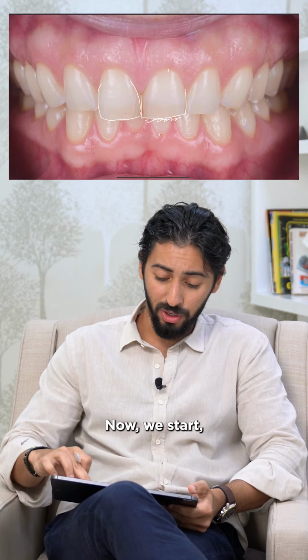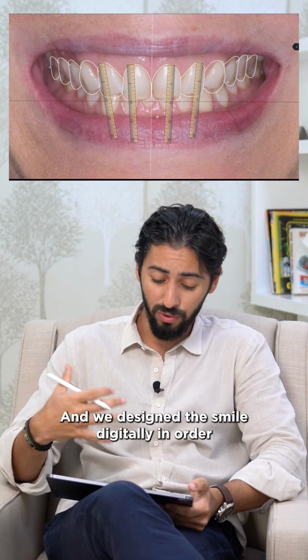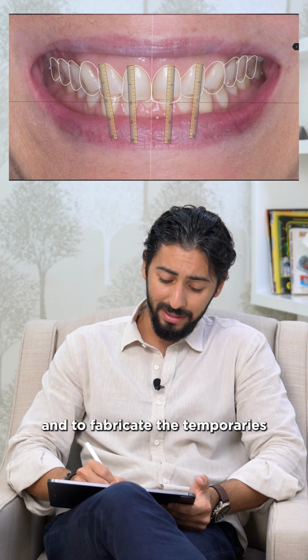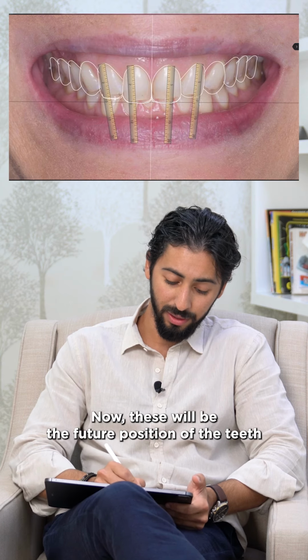Now, we start first of all by taking the pictures and doing what we call the digital smile design. And we design the smile digitally in order to send all of this information to the lab technician and to fabricate the temporaries. Now, these will be the future position of the teeth.